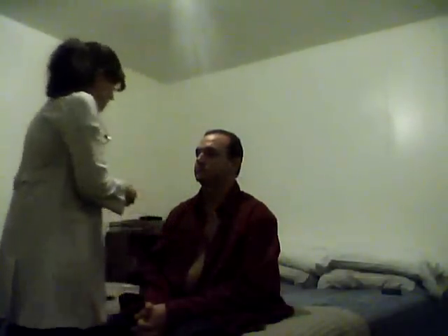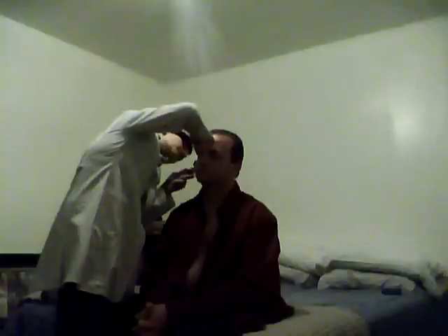So then you're going to look inside the ear. On adults, you pull back, up and back. And you look in, you're looking at the tympanic membrane, looking at the canal. The tympanic membrane should be good and white, pearly, transparent.